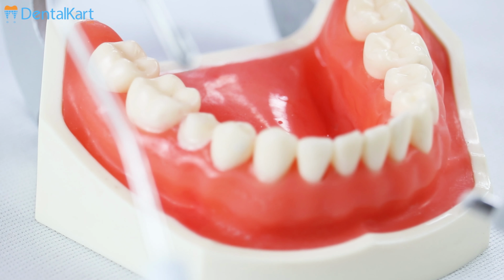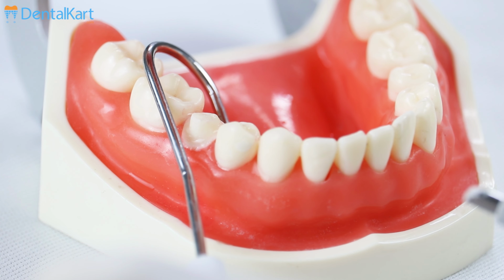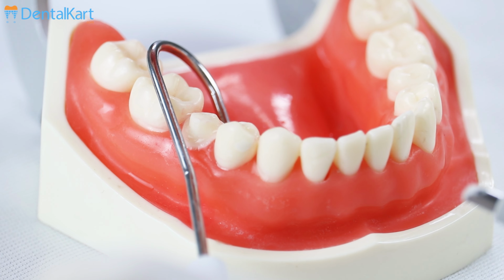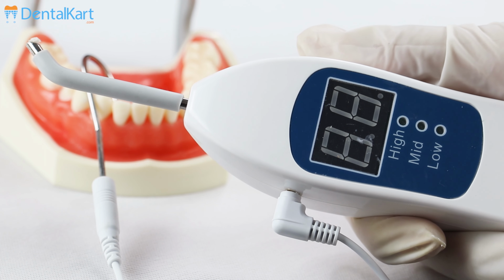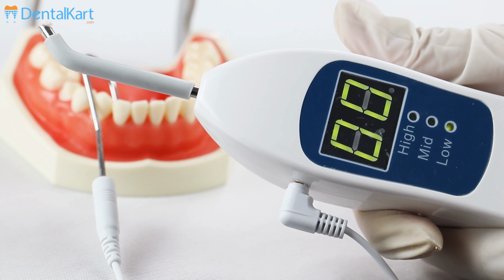Then complete the circuit by placing the lip clip on the patient's lip or ask the patient to hold the lip clip with their bare hands. Turn on the device and select the mode to introduce minimal current onto the tooth.